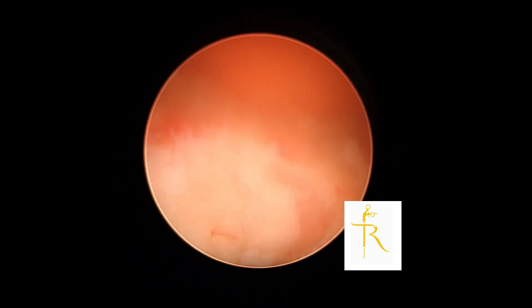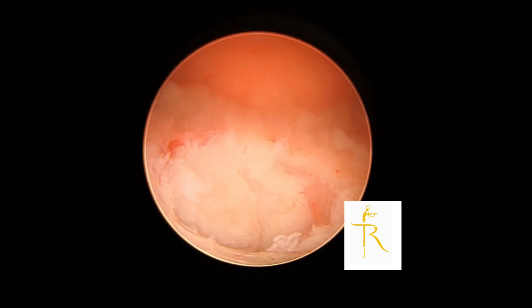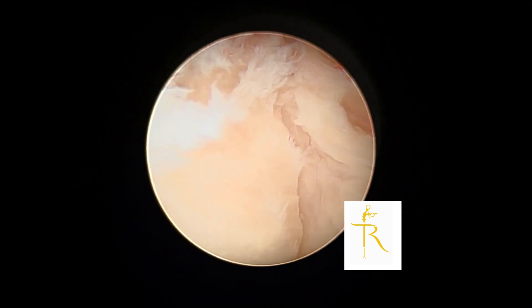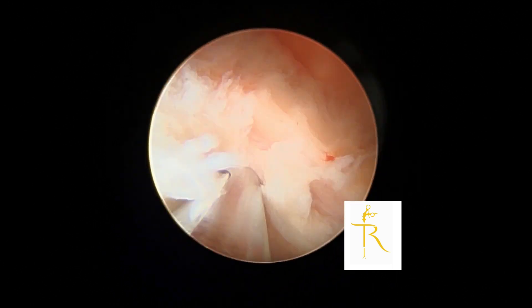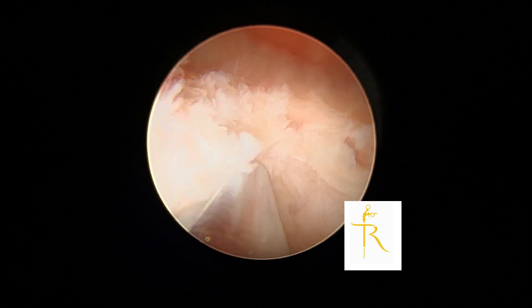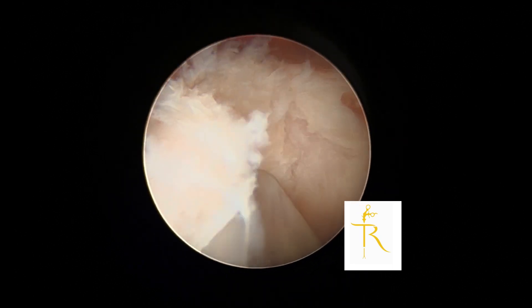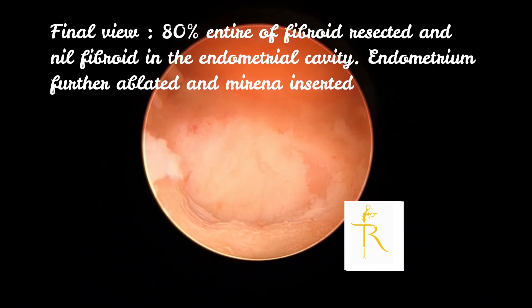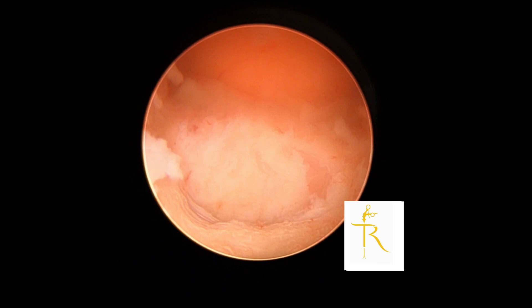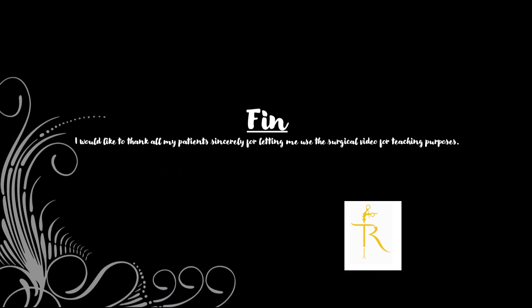You can see there's just a little bit more of the fibroid left — it was a 2 by 1 centimeter fibroid and most of it is almost resected. You can see we've gone into the muscle and we're resecting most of the fibroid out. The white of the fibroid is clearly visible compared to the adjacent pink of the muscle. We then went ahead and ablated the endometrial cavity for this woman and put a Mirena in as well, hoping to stop all problems of abnormal uterine bleeding.